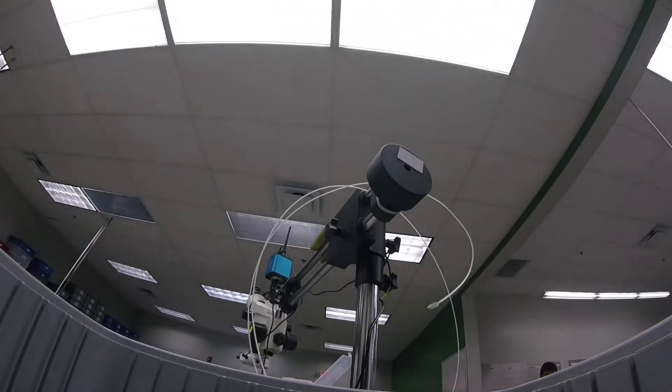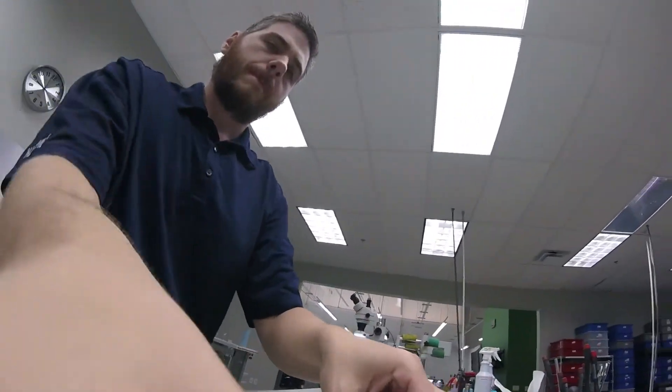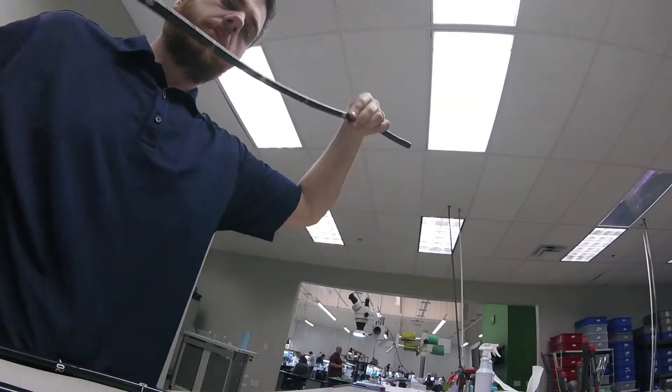Once checked in, the operations personnel transport the scope to the inspection area. With all the paperwork in order, an experienced lab technician begins the repair process, working diligently to ensure your scope is returned as quickly as possible.